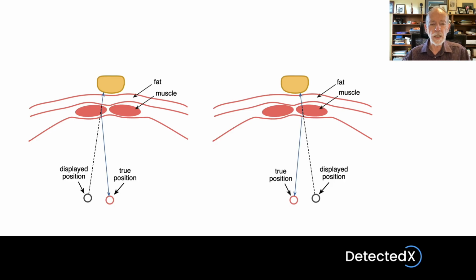And so we've essentially got the SMA being displayed to the left and to the right of its true position. So there's a doubling of that caused by this particular effect. Note that I have exaggerated the amount by which it is displaced, just simply for clarity in this diagram.